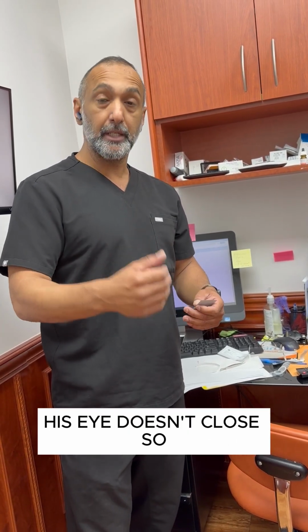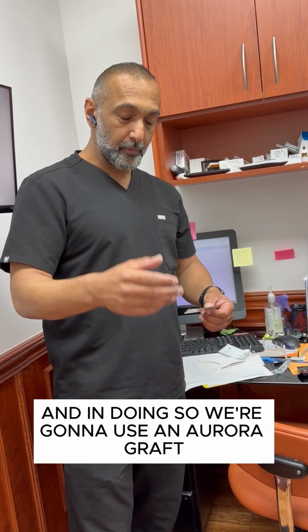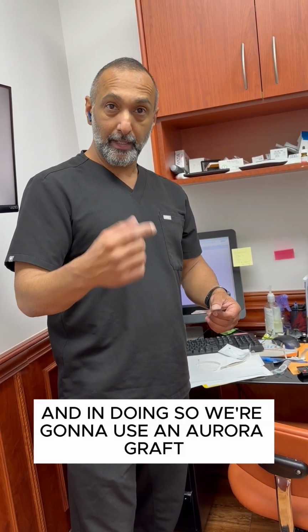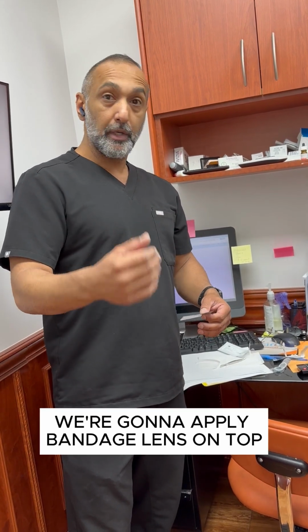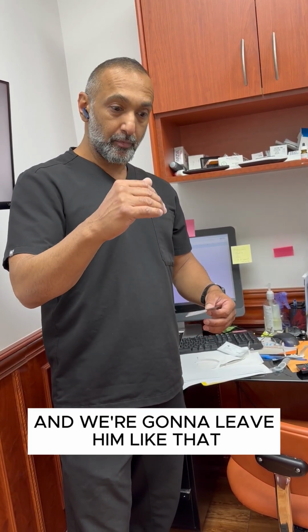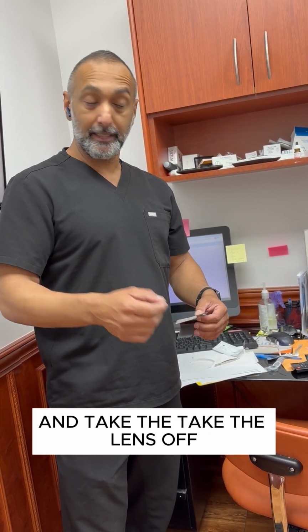His eye doesn't close. So what we're going to do is an amniotic graft on the right eye. In doing so, we're going to use an Aurora graft that has the central aperture, 5mm central aperture, so we can still see. We're going to apply a bandage lens on top, and we're going to leave him like that for a couple of days. We'll bring him back in about 2 days and take the lens off.